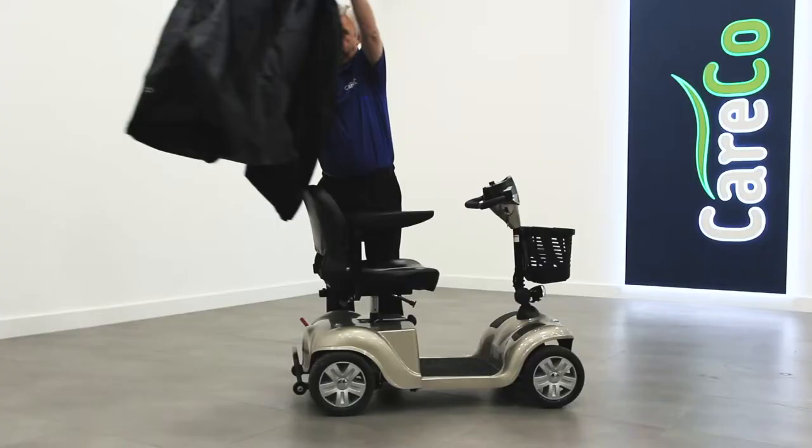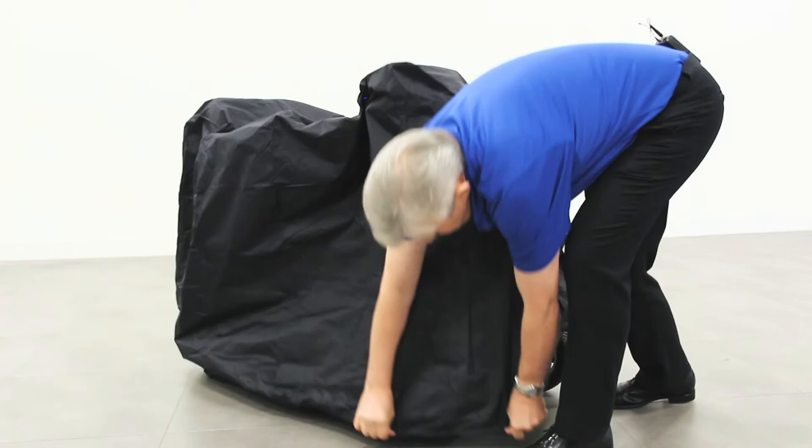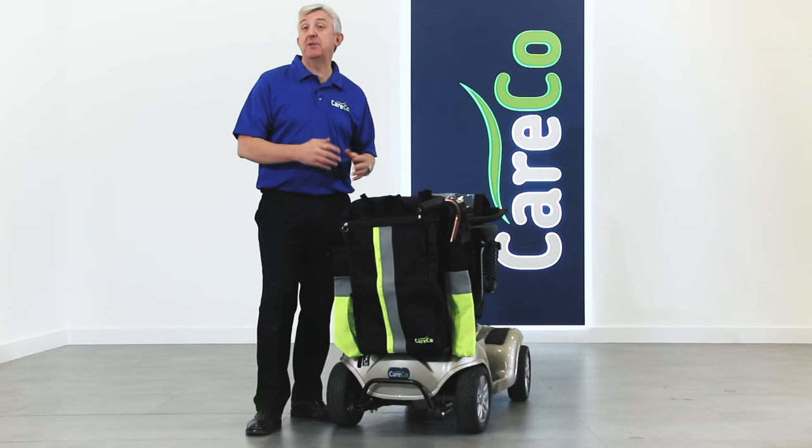Completing the Hi-Viz accessory pack is the Careco scooter storage cover. This waterproof sheet fully protects your mobility scooter from rain and scratches while it's stationary. The lightweight flexible material makes it easy to pack up and take with you on your travels.